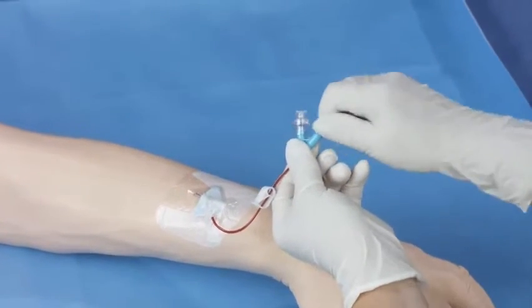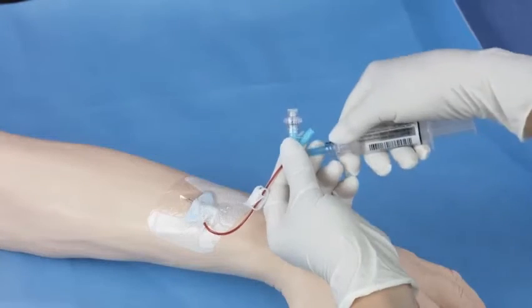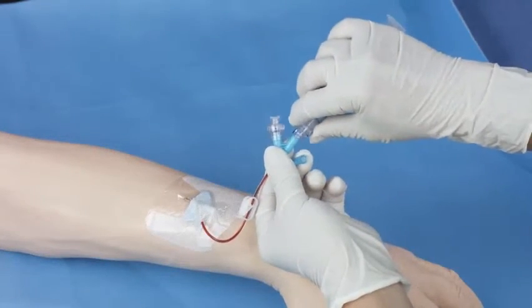Remove the vent plug and replace it with the needle-free connector included in the package. You may pre-attach your flush syringe for convenience.